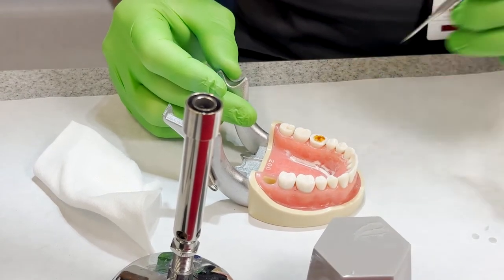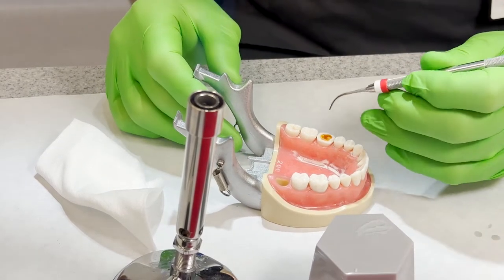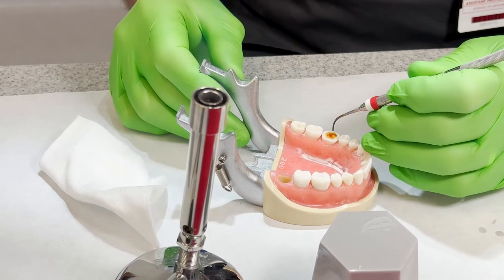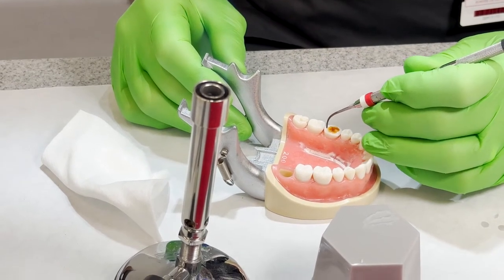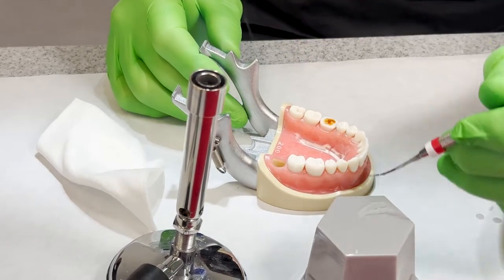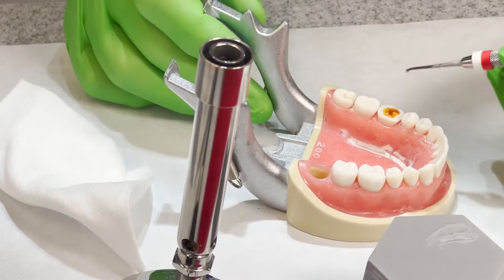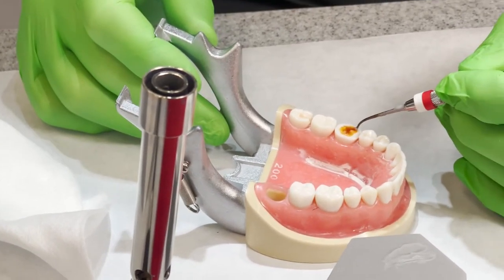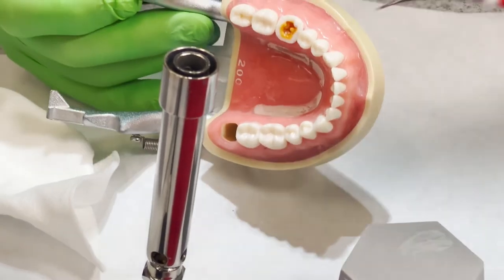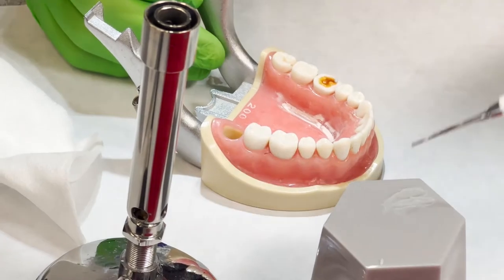When I feel like I've got it sufficient, I'm going to go ahead and start. So what I want to do is look at the opposing tooth and kind of give that as a background, but I'm going to start with the cusp tips. I know this tooth has 5 different cusps, so let me just see if I can get it going here. Can you see that? I'll get them a few more here.